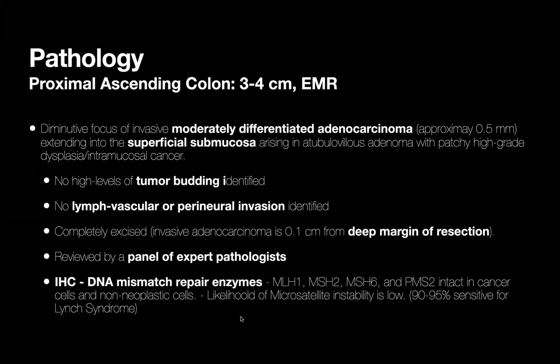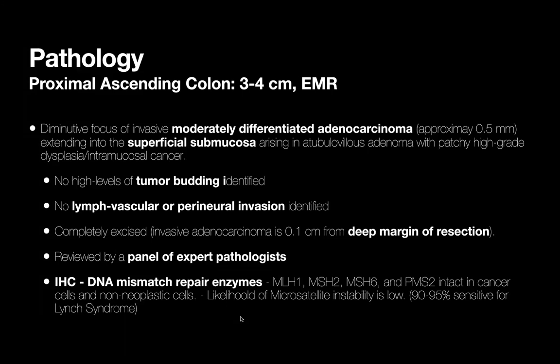No high levels of tumor budding identified, no lymphovascular or perineural invasion identified. Completely excised, invasive adenocarcinoma is 0.1 centimeter from the deep margin of resection, reviewed by at least 2 pathologists, and we actually reviewed it as part of our weekly pathology conference.